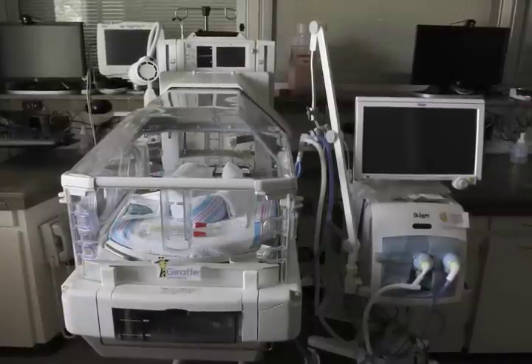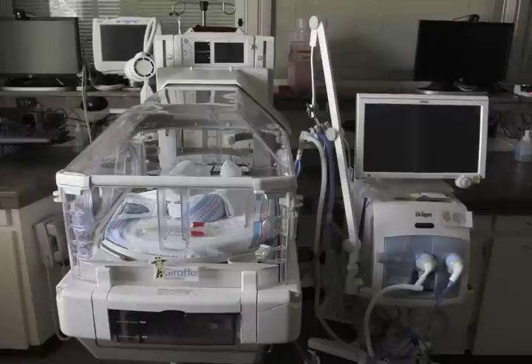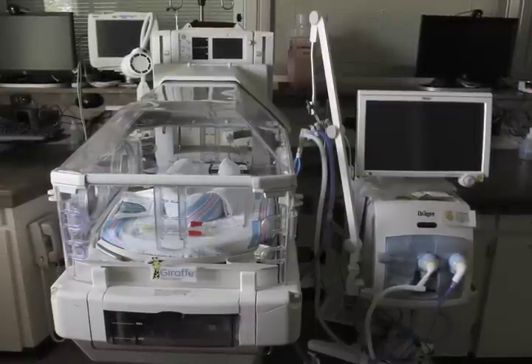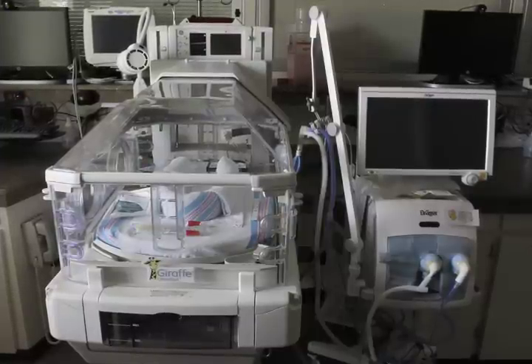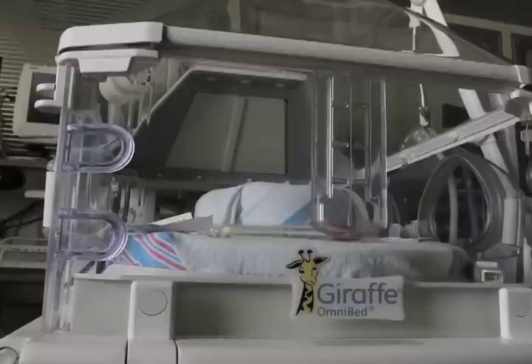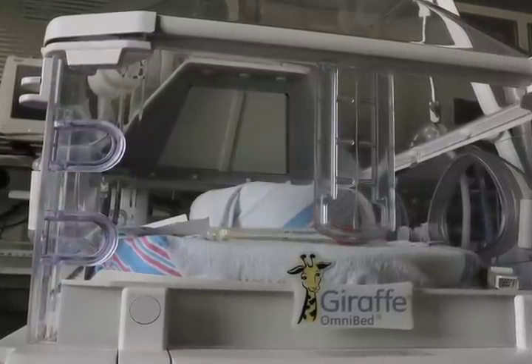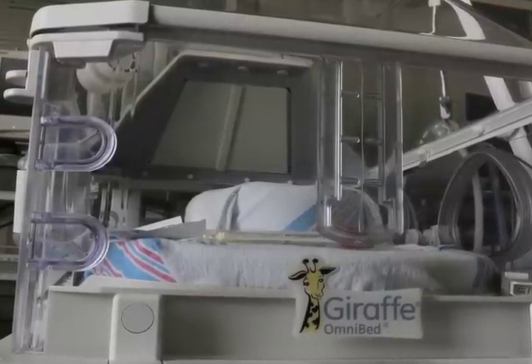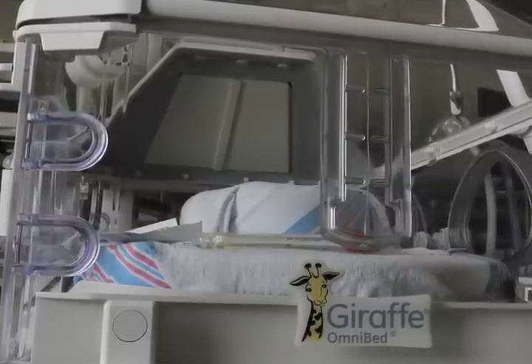There are 2 types of beds utilized during the admission of a baby in the NICU. The giraffe bed pictured here is used for micropreemies and smaller babies meeting certain criteria. These specialized beds feature a component that keeps the bed warm when portholes are open, provides humidity to protect the fragile skin of the baby, and a built-in bed scale for weight measurement. The giraffe bed can be utilized as a radiant warmer by opening the top portion and sides of the bed, giving complete access to the baby as care requires it.